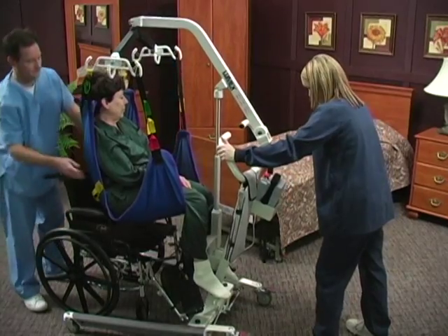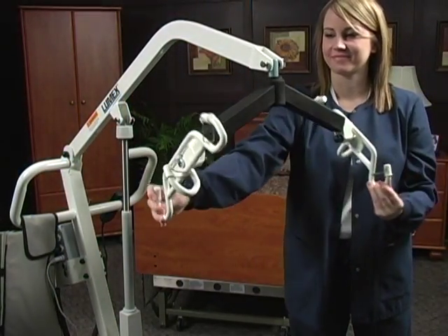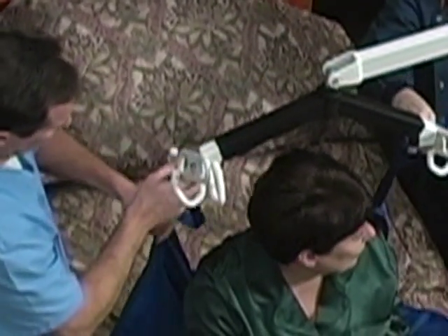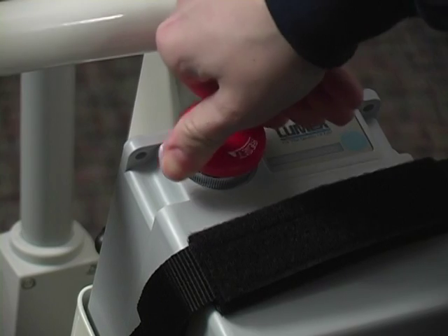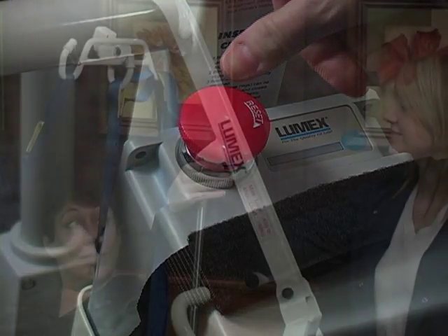The spreader bar has six points or hooks. The spreader will turn and tilt to ease attaching a sling to the lift for resident positioning. You can use two, four, or six-point slings with this lift; a two-point sling is used in conjunction with chains. Your lift is equipped with an easy-access emergency stop button — depressing it will immediately stop power to the lift. Twisting the auto stop button will resume power. Your lift also has an emergency lowering device to use during a power failure.